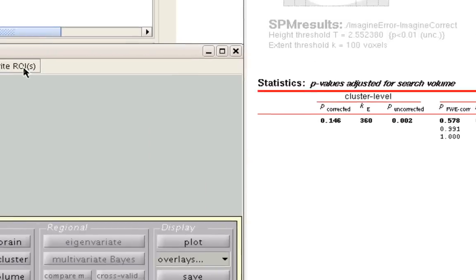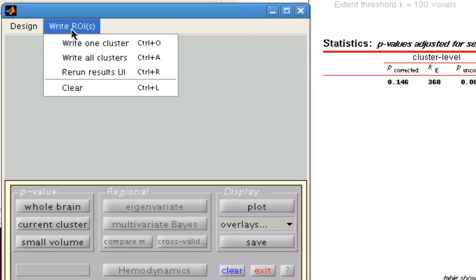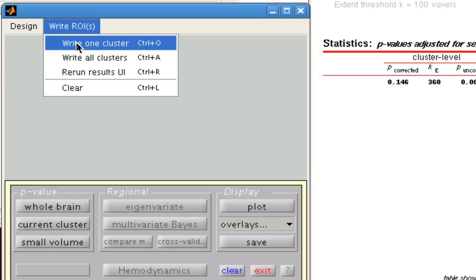After you've done that, go to this Write ROIs menu, and click on Write One Cluster. Conversely, you could also write out all the clusters if you wish to. But for here, we're only focusing on one cluster from an analysis we've run.